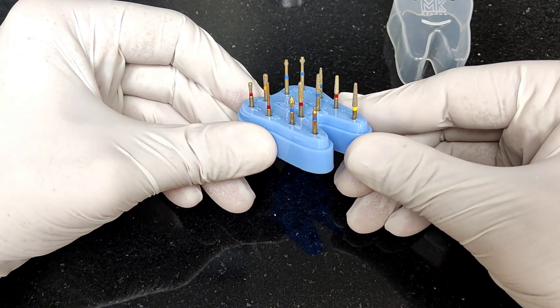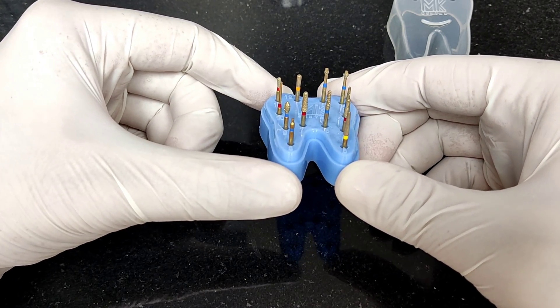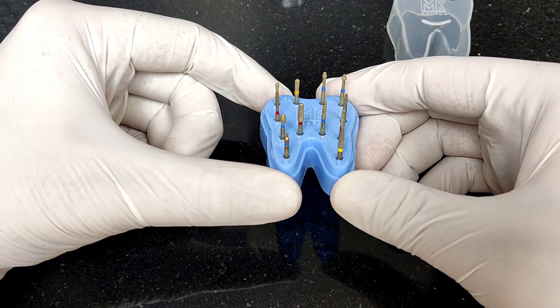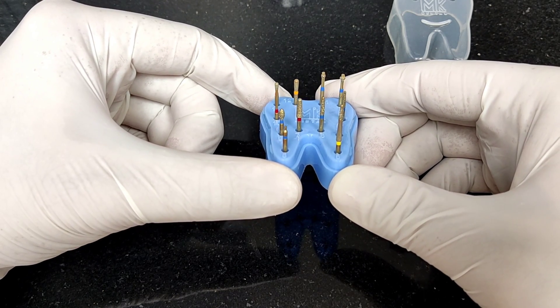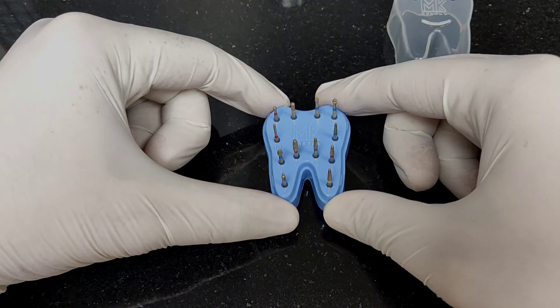The kit is available at mikdental.in. These are all gold series burrs, which allows them to prep faster and they tend to last longer than regular burrs. Don't wait — log in to mikdental.in and place your order today.